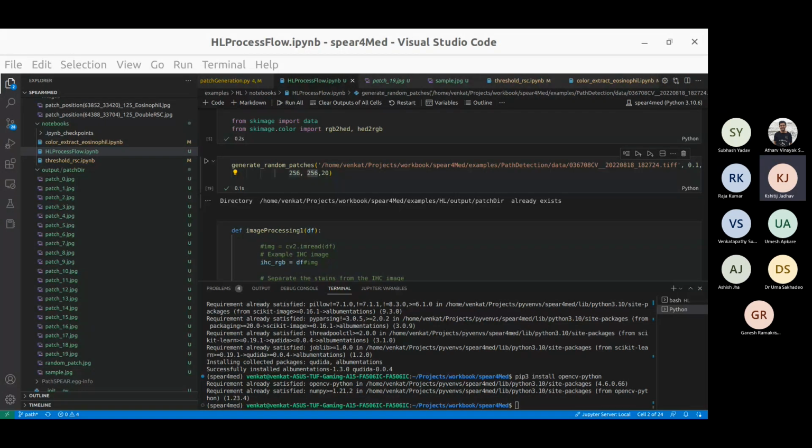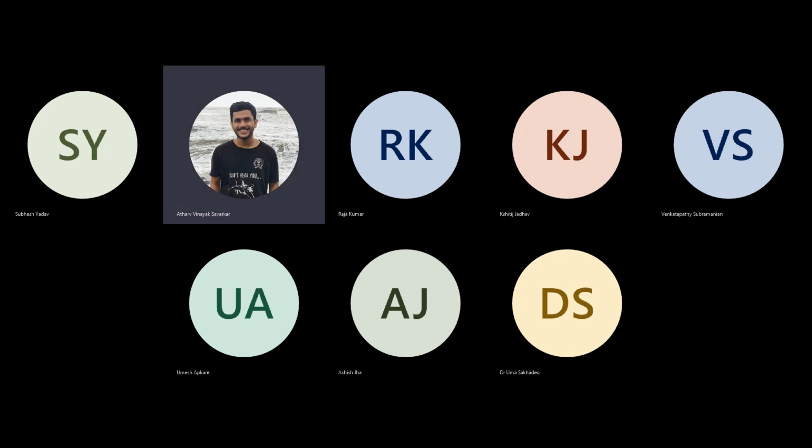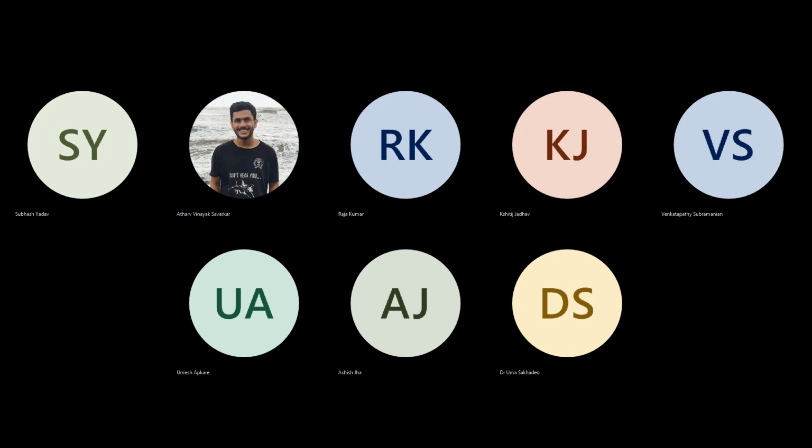Okay. Thank you. Venkat, should we request Atharva, because Dr. Ashish is also here? Yes. So Atharva will show his segmentation for the CT scan images. Yes, sure. Can you just give me the share access?